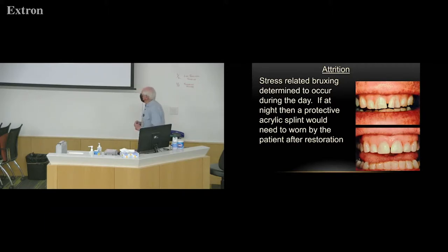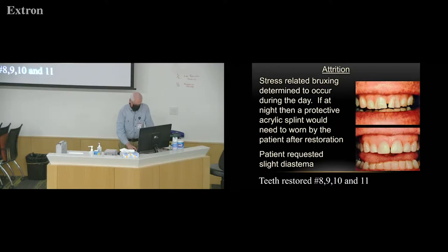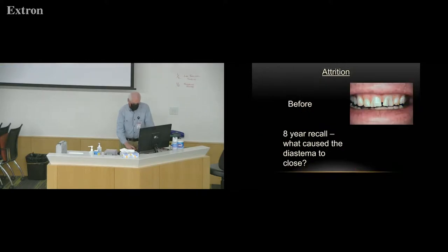Now, I like to close diastemas. I don't like spaces. But the patient asked me not to close the diastema because people would think he looked different or something. He sort of liked having a little space there. So we left it open. Okay, let's follow through into the future. So this is the before picture. And can you kind of visualize in your mind how you would approach this?